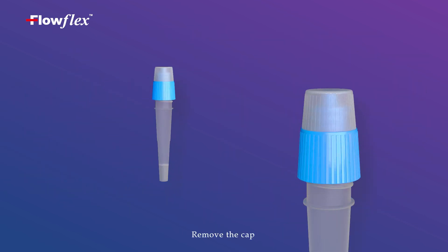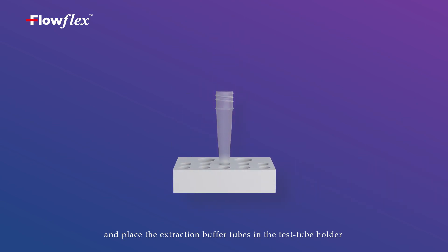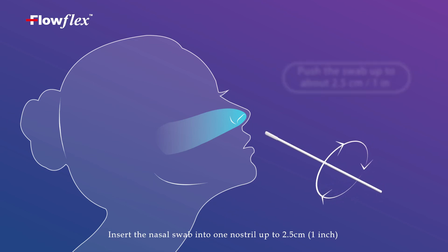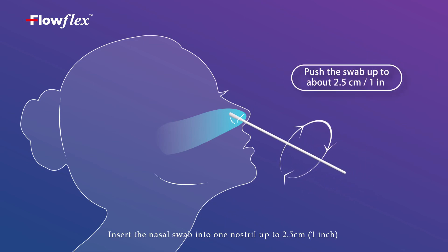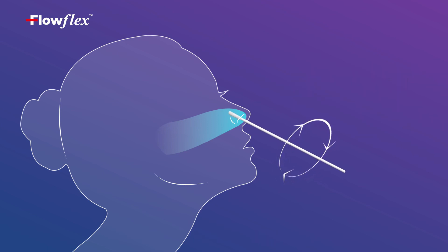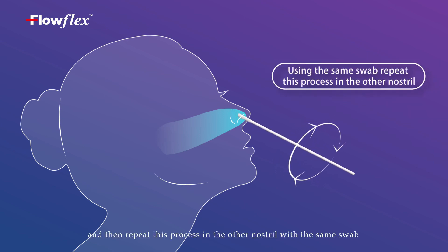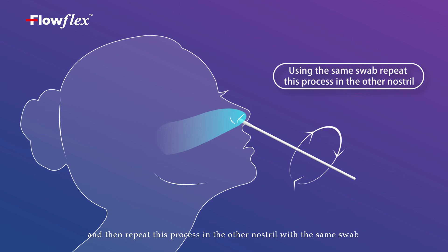Remove the cap and place the extraction buffer tube in the test tube holder. Insert the nasal swab into one nostril up to 2.5 cm from the edge of the nostril. Rotate 5 times, then repeat this process in the other nostril with the same swab.